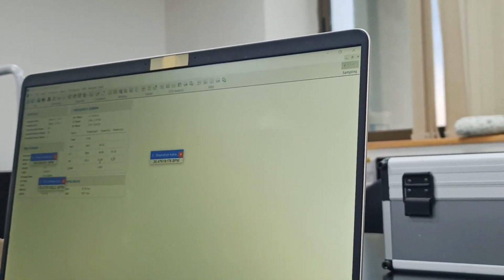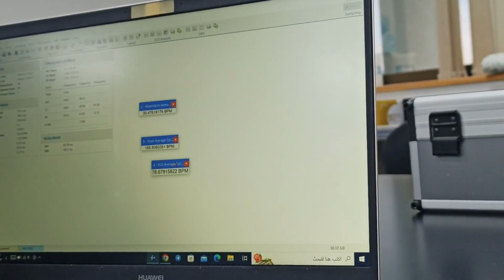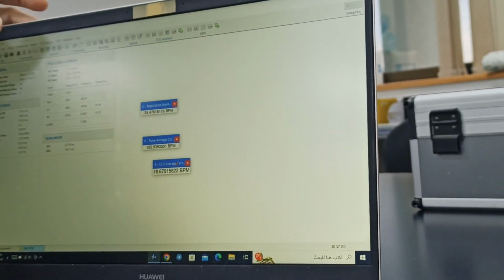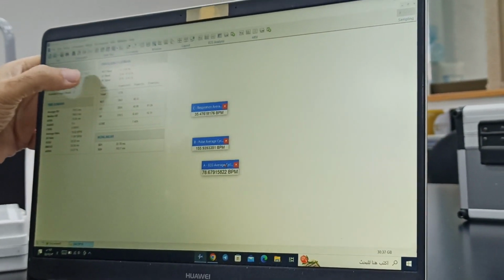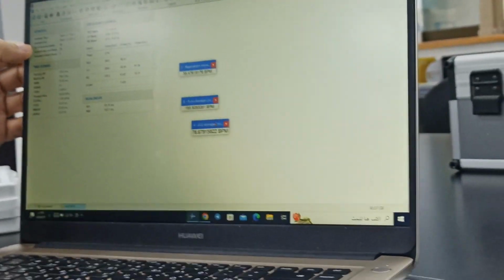Now I'll just quickly tell you the things. You will have the start of the analysis defined at time interval 7 minutes 24 seconds, and where the analysis ends. It should show total included beats.